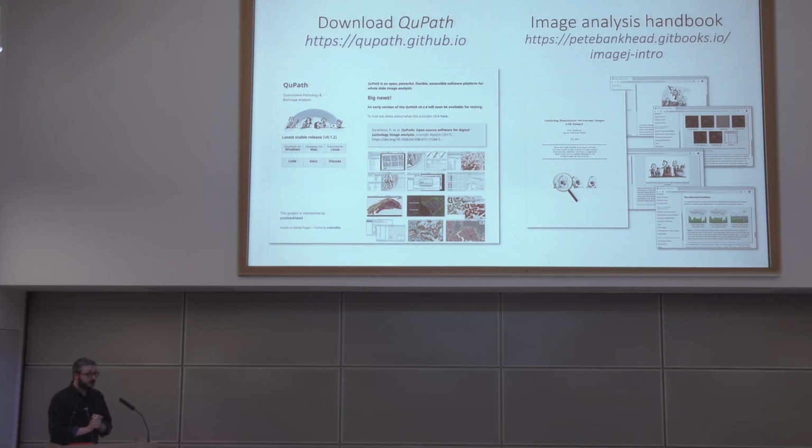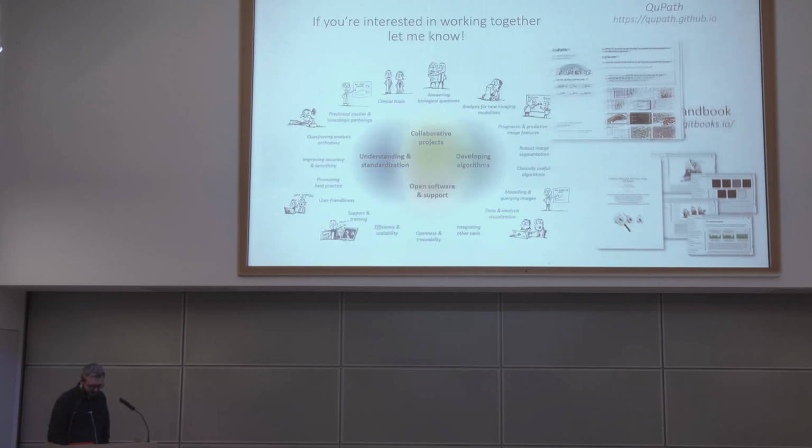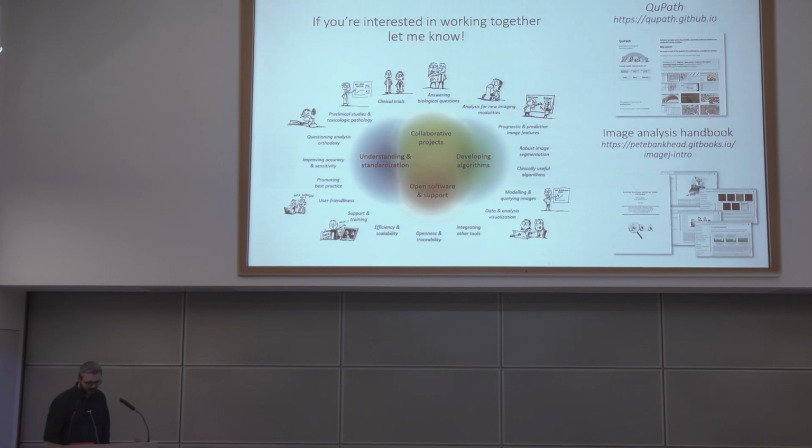So some of what I showed you is not, as you can see, ready for widespread use. The best way, if you want to work with it, is to discuss with me how that can be done, because I am currently the bottleneck on quite a few projects, and yet keen to complete these tools so that they can be widely used. So if you want to work with me, let me know.